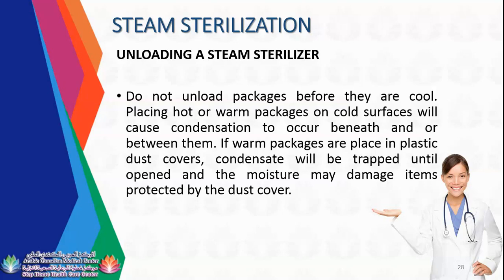If you remove hot instruments and place them directly on your working area, especially a metal surface, it will create puddles of water or steam. It can create steam, so it can cause wet packs. So remove it once it is properly cool.